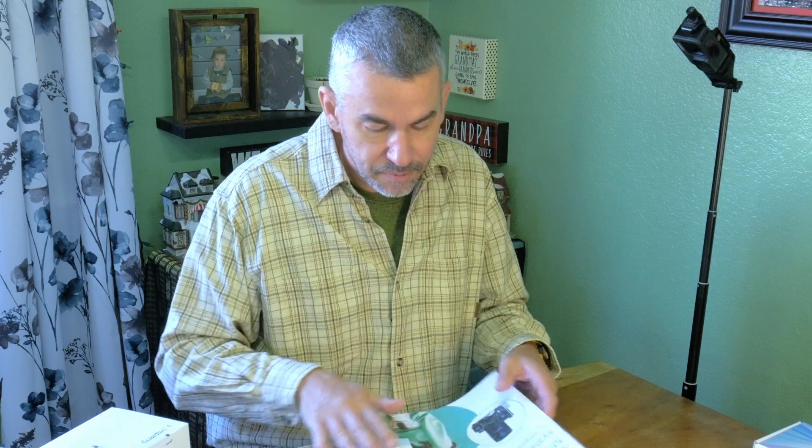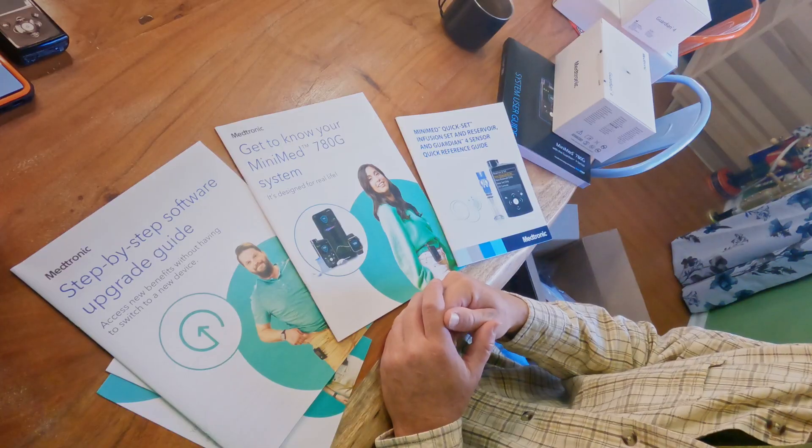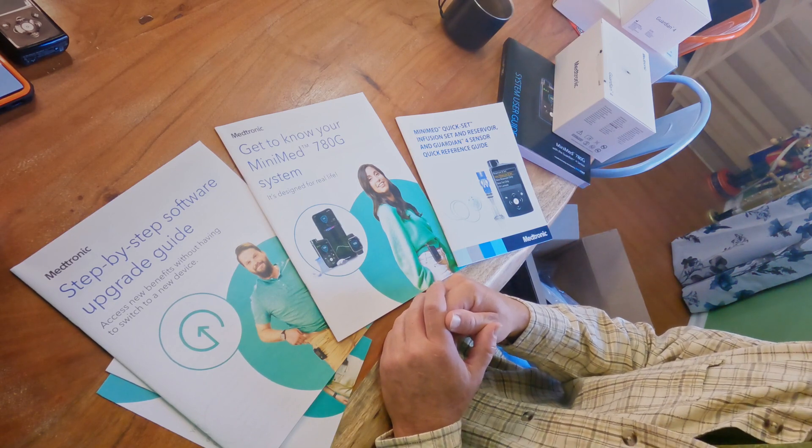The important things you get are the transmitter, sensor, a new manual for the upgrade, the upgraded pump, and then the guide that you would possibly need if you don't have an internet connection — which you should.